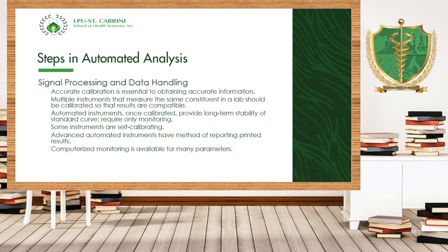Okay, so signal processing and data handling. Okay, the accurate calibration is essential. Bakit kailangan yan? Bakit kailangan ang accurate calibration? To maintain the integrity of the machine, to maintain the reliability and accuracy of the result. Okay? Multiple instruments that measure the same constituent in the lab should be calibrated so that the results are compatible. Okay? Automated instruments, once calibrated, provide long-term stability and standard curve.